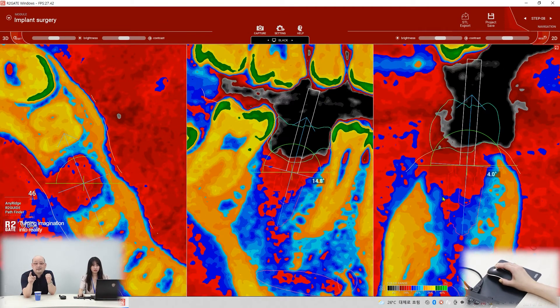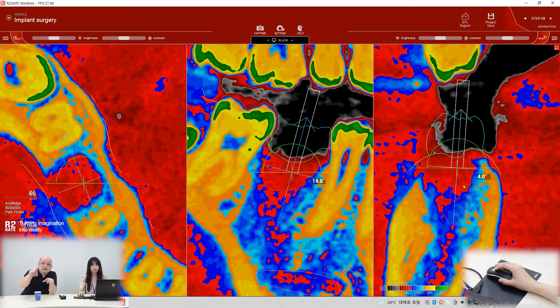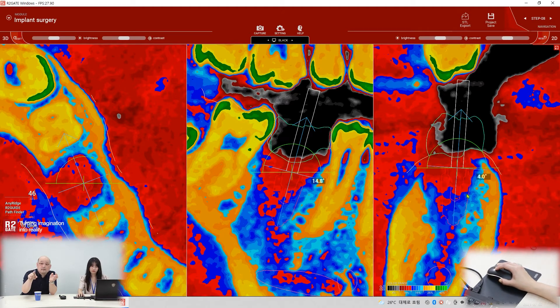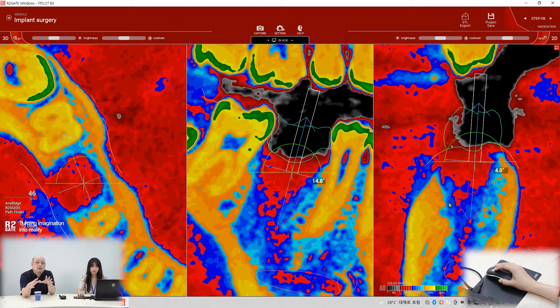I think this is the extraction socket, so new bone is not healed yet. The outside of bone is yellow color — that means it's cortical bone. But inside is blue, red, and sky blue, which means it's medium bone and soft bone.